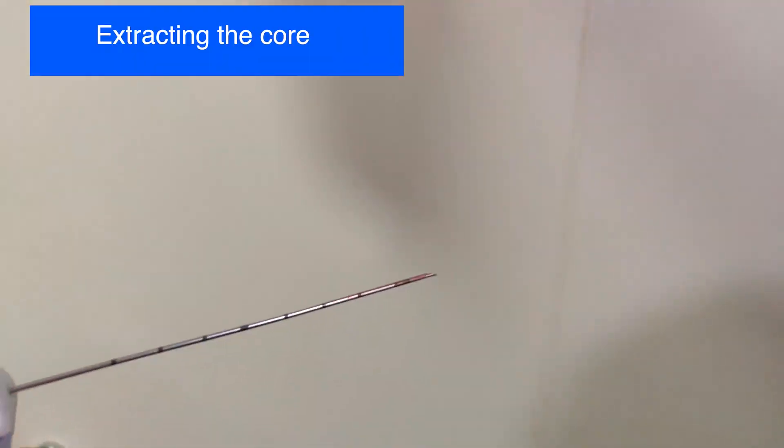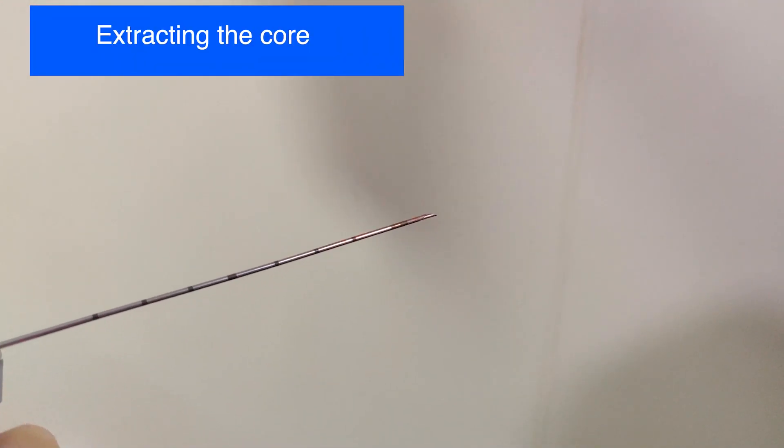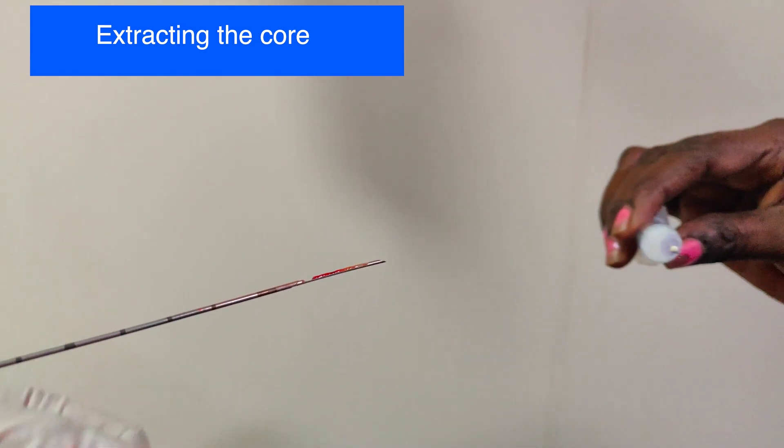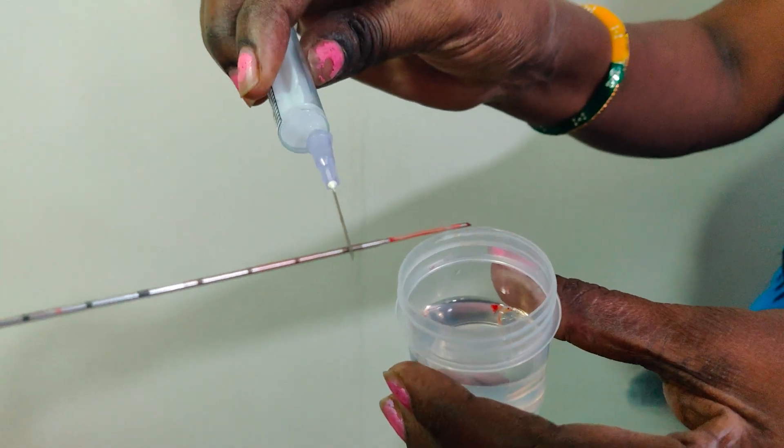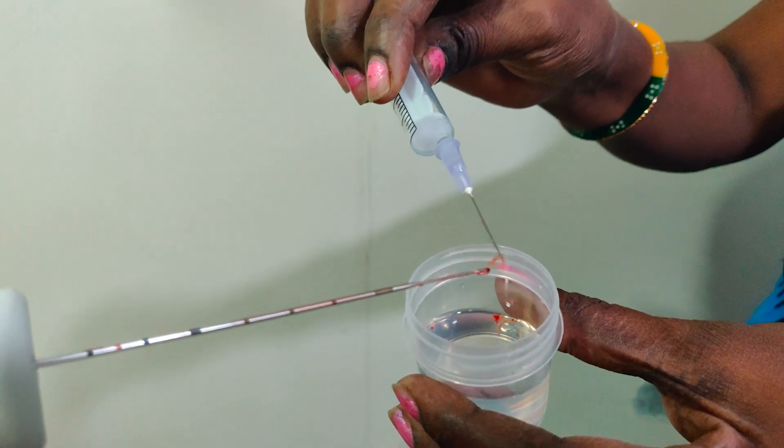So now I have collected the core specimen. Once I pull the outer loading button, it exposes the inner stylet that contains the core specimen. This is picked up with the help of a needle and placed in formalin.